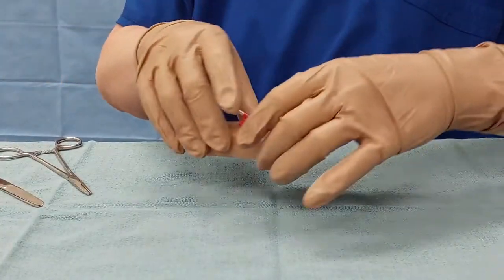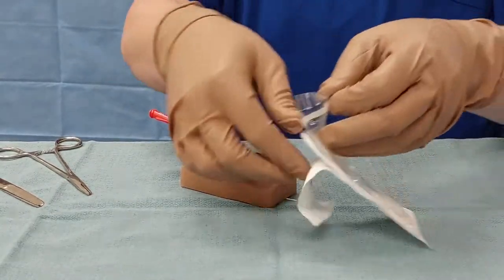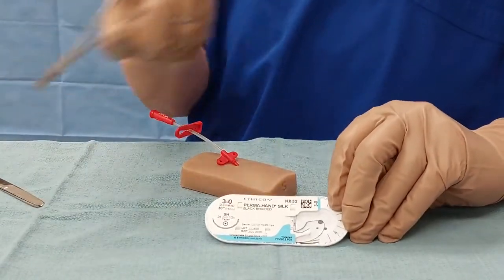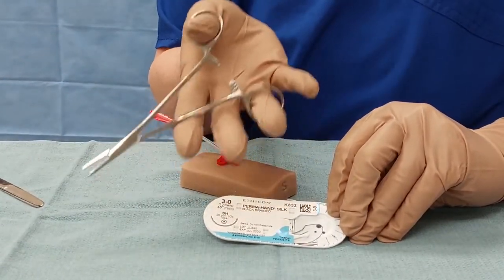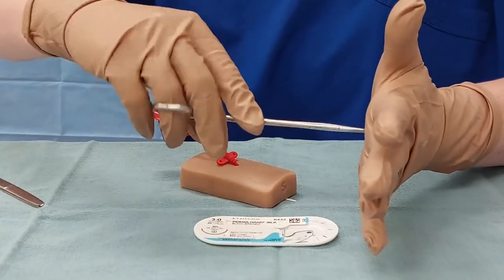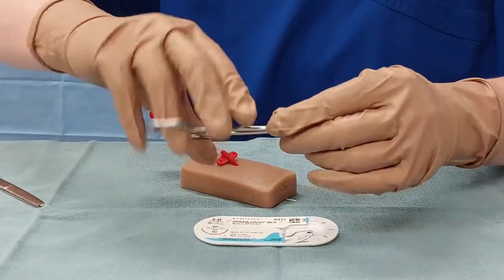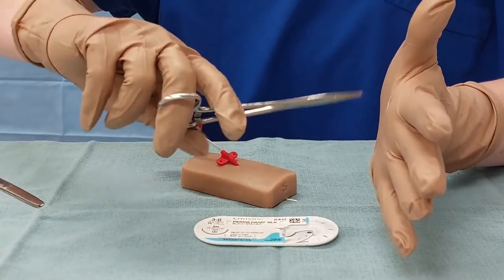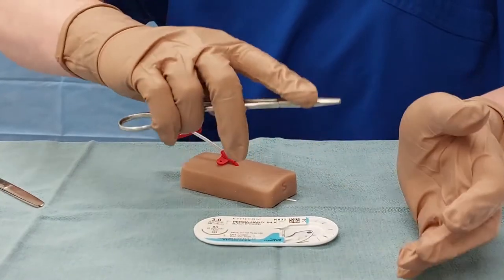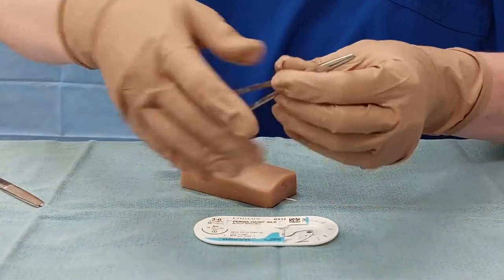We're going to start by loading our sutures. When you open your package, you're going to see that the needle is accessible. Hold your needle drivers using the fourth finger — when you turn your arm, it's like turning a key, and the needle driver tip stays in the correct plane. If you use your third finger, this wants to swing a big arc. Alternatively, you can load your suture and just hold the drivers without using your fingers through the holes; that would also be acceptable.